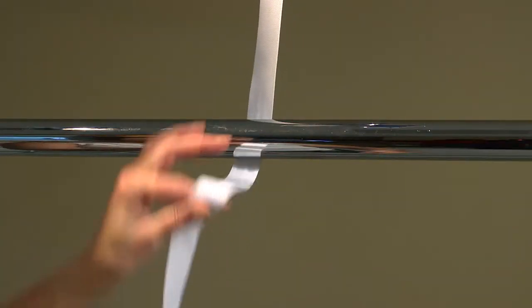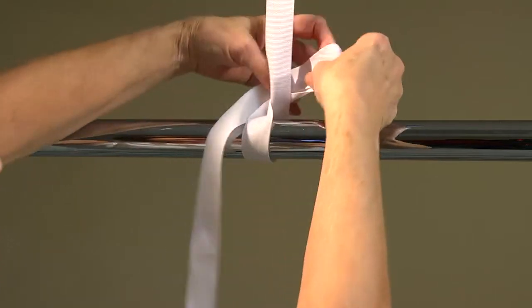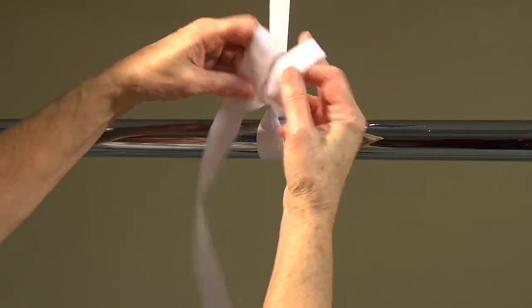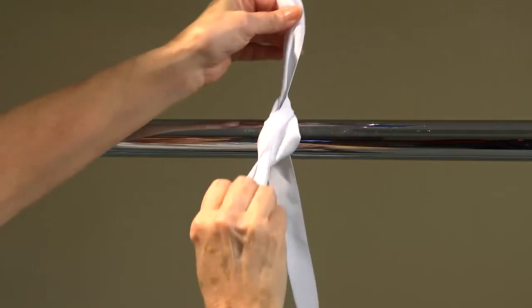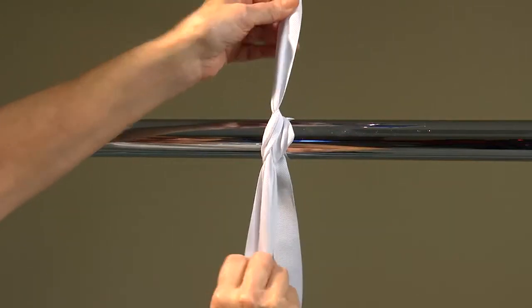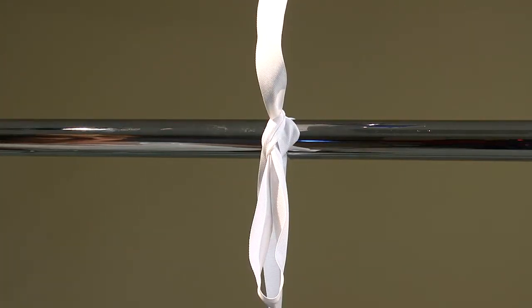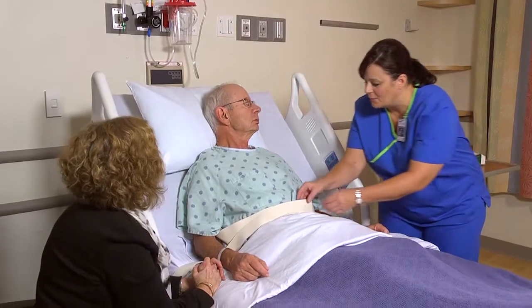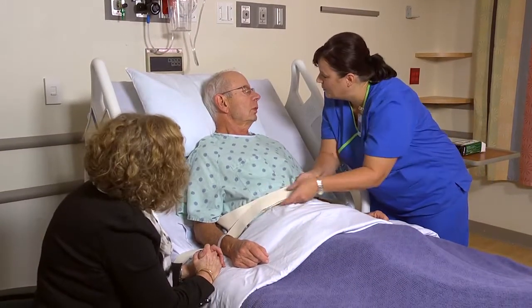Restraints are secured with a quick release tie, a buckle, or an adjustable locking device that works like a seat belt. Do not tie the straps of a restraint into a knot. Let me just check the straps — how's that feel?